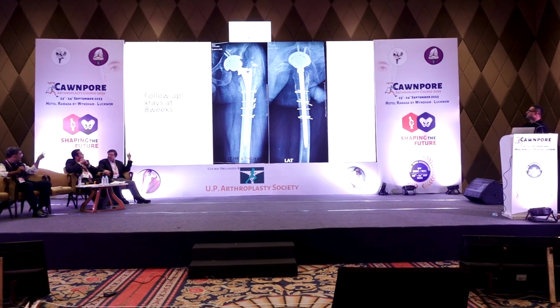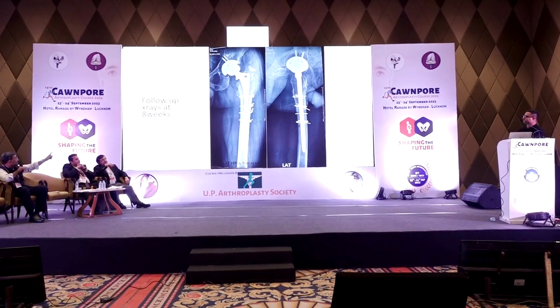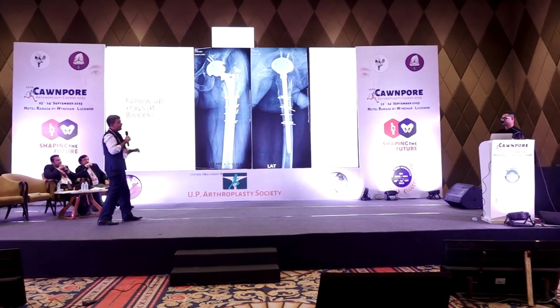Use multiple screws. Yeah, it was a multi-hole cup mostly. That looks like a multi-hole cup. Can you see that? It was a Zimmer cup. It is a multi-hole cup. If you looked at the X-ray, it is a multi-hole cup. If you look carefully, it is a multi-hole cup. Yes, sir, you had that option without changing the cup.